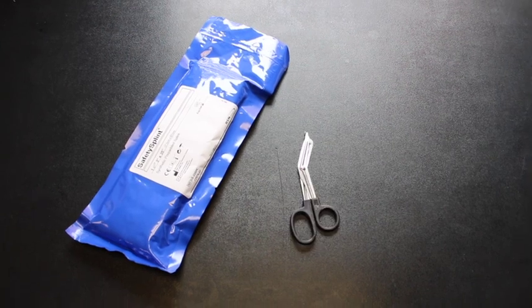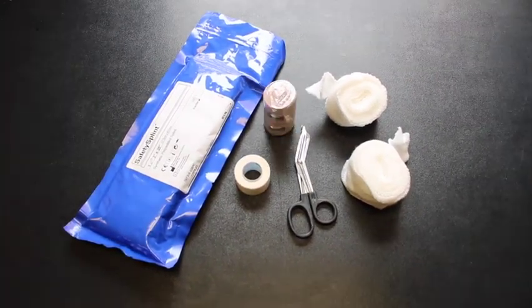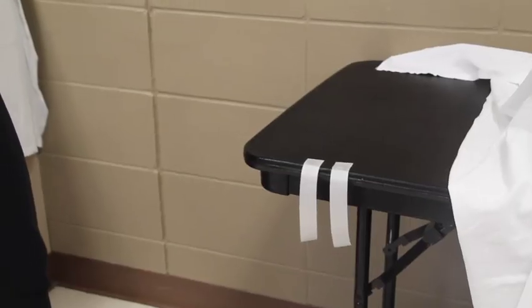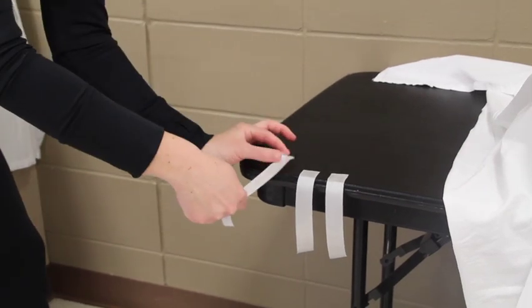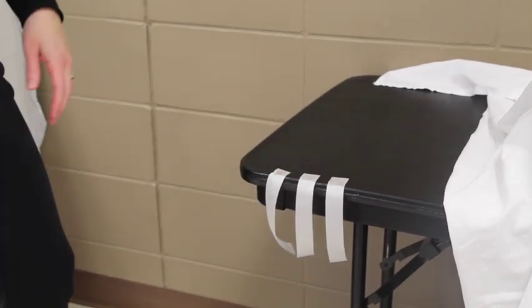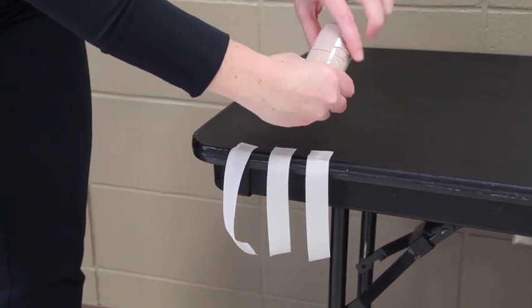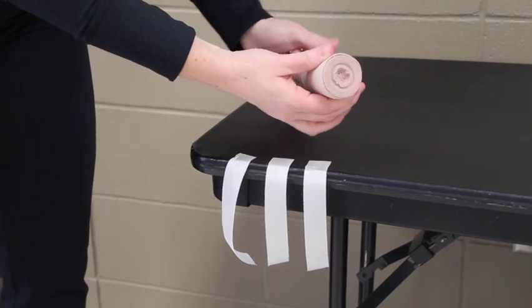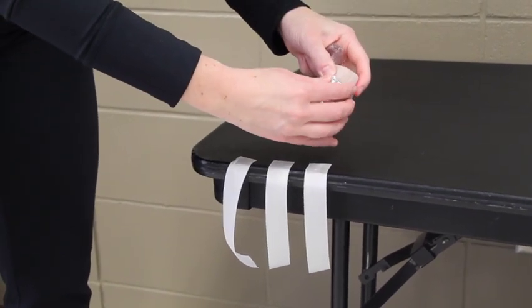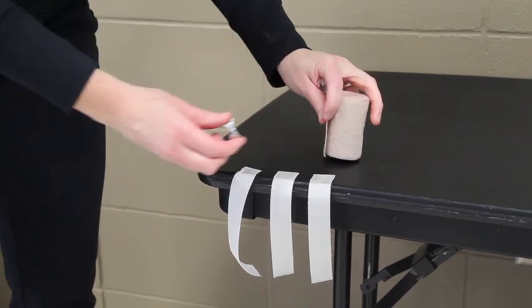Materials needed: a ready-made splint, scissors, two-inch padding, tape, and three-inch elastic bandage. Tear off some pieces of tape so they are within reach at the end of the splint. Then open the elastic bandage. Some packages have a red dotted line in the middle — twist to open the plastic, it's much easier to take off. I recommend taking those sharp clips and throwing them in the garbage, as they tend to hurt people.